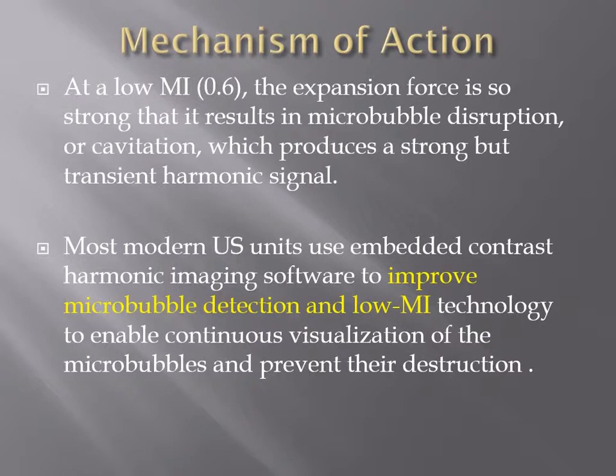The expansion force is so strong that it results in microbubble disruption or cavitation, which produces a strong and transient harmonic signal. After it oscillates and produces this signal, it will start to disrupt. That's why modern ultrasound units improve a specific parameter in the device that improves microbubble detection, and low MI technology enables us to have continuous visualization of these microbubbles before they start to destruct or disrupt.